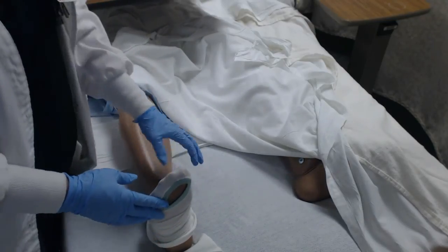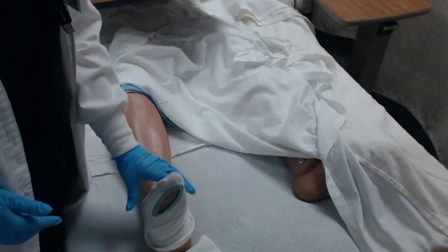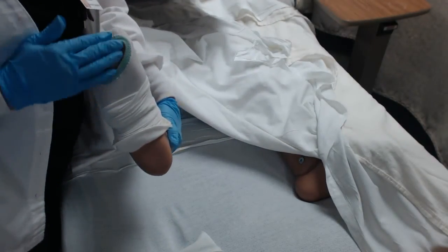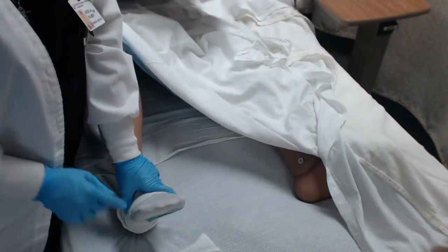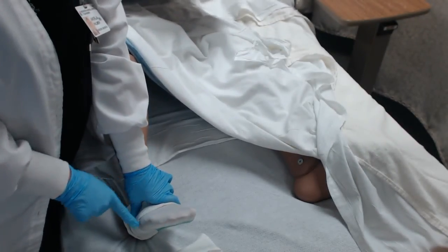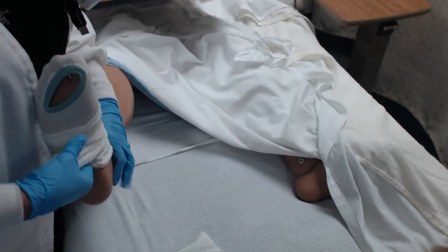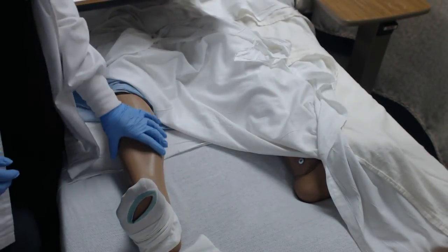Then you're able to go up and around the leg, but it's too hard for me to do with my patient here. As you can see, the hole is on the bottom, and the top fits perfectly where the toe bed should go. If I were able to pull this all the way on, there's actually a spot for the heel of the patient as well.